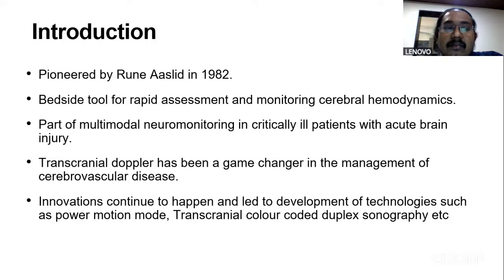Now TCD is used routinely at the bedside for rapid assessment and monitoring of cerebral hemodynamics, and is also a part of multimodal neuromonitoring in critically ill patients with acute brain injury. It has been a game changer in the management of cerebrovascular disease, especially subarachnoid hemorrhage.